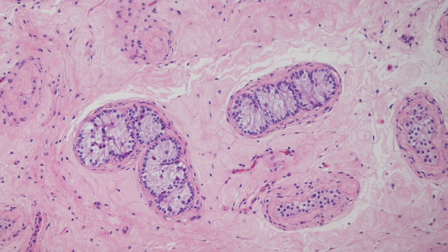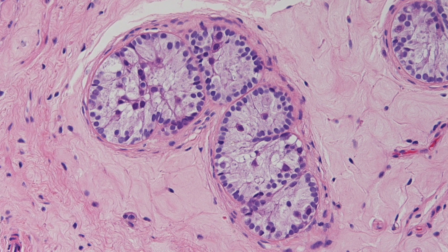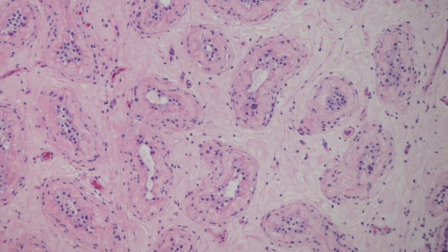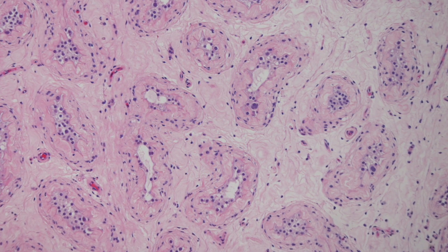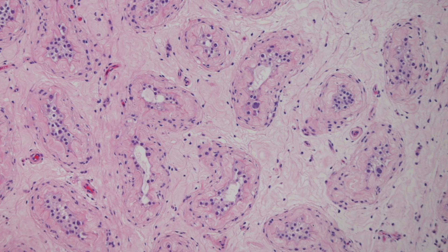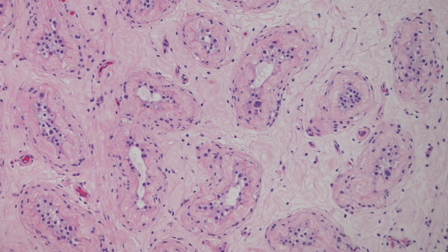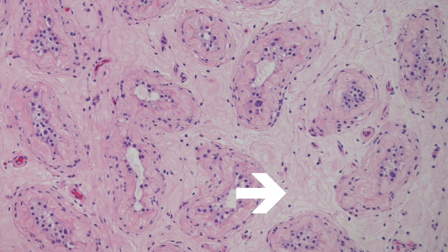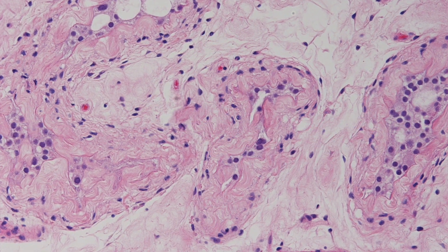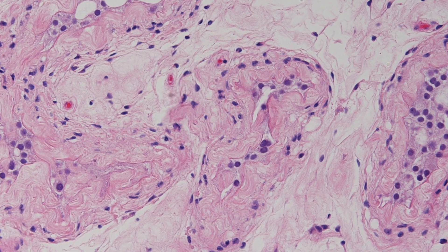Here is a small nodule of tubules containing Sertoli cells only. Here you can see tubules showing very marked peritubular fibrosis with either absent or very markedly reduced spermatogenesis. The other feature present is expanded interstitium virtually devoid of Leydig cells. These tubules show such extreme fibrosis that they have been virtually obliterated.